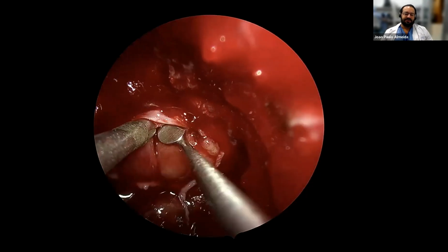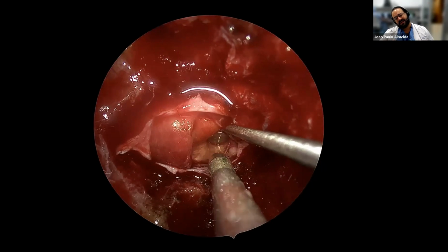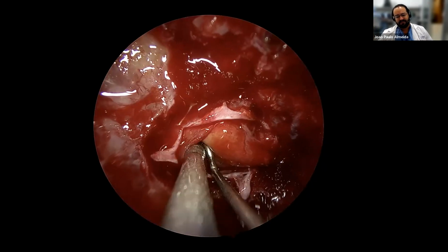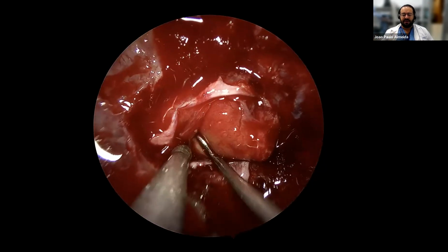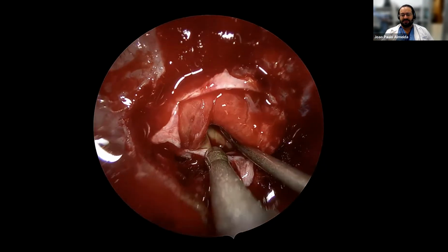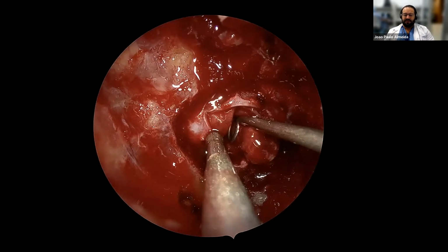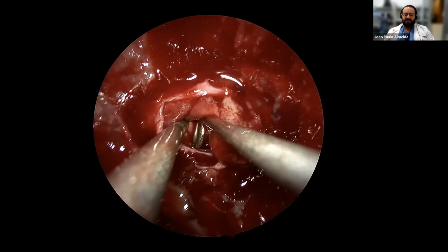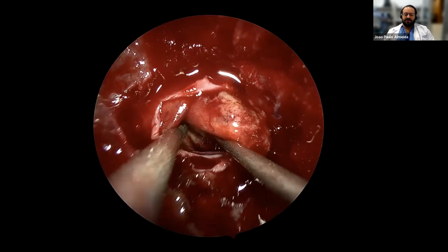In this case, we're trying to preserve that pseudocapsular plane. But once again, the tumor has a lateral extension on the left side, and that would preclude us, at least preclude me, of achieving a full en bloc resection. But to try to preserve the pseudocapsular plane remains important, so you can separate the part that you definitely must separate, which is the one in contact with the gland.